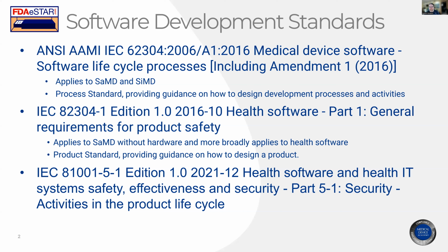If you don't have medical device software, I can understand why you might not be familiar with this standard, but there is such a huge difference in the documentation expectations, not so much how many documents you have to create, but what they're called, what the jargon is, how they're labeled, and how it has to be organized. This is the standard you need to be following.